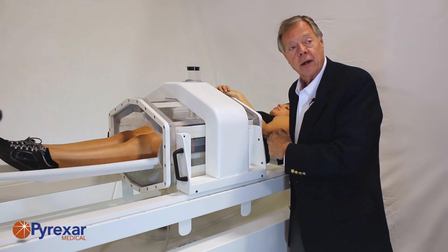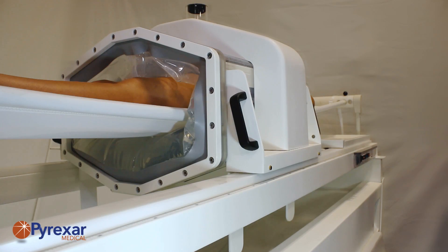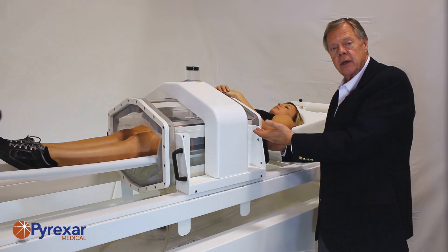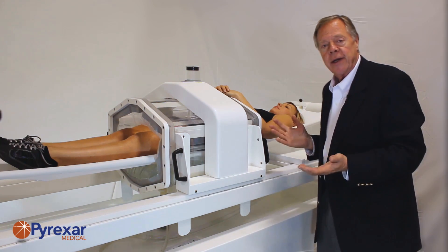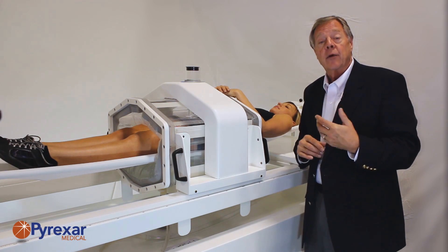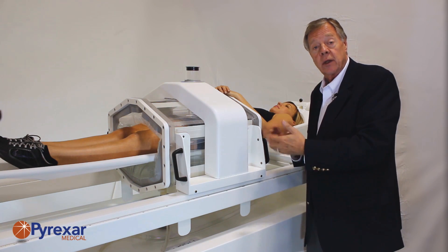With water being a very high dielectric with smaller wavelengths, these antennas are sized to be very efficient at focusing the energy inward to the patient's body. As the water fills around the patient's body, it only takes a short time to fill completely. Any air trapped inside the bolus space is automatically purged and removed through an opening on top, making a complete water cuff of deionized water surrounding the patient's body. We use deionized water because it provides very low losses, so the energy can pass through the water without absorbing much energy within the water space.